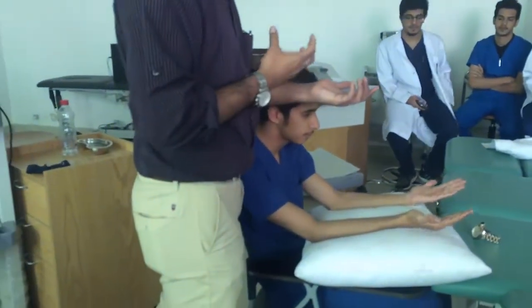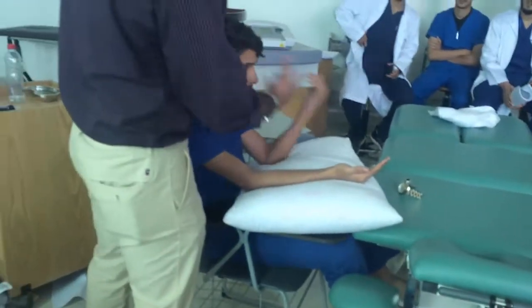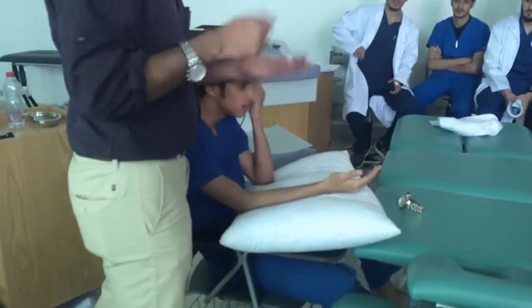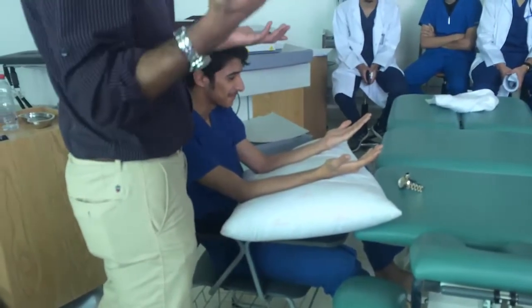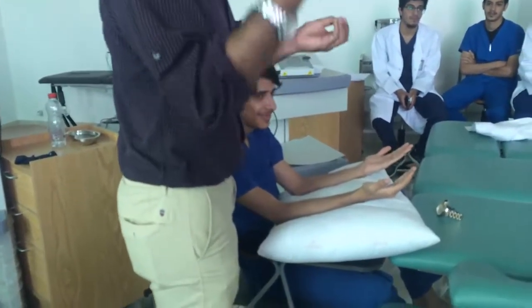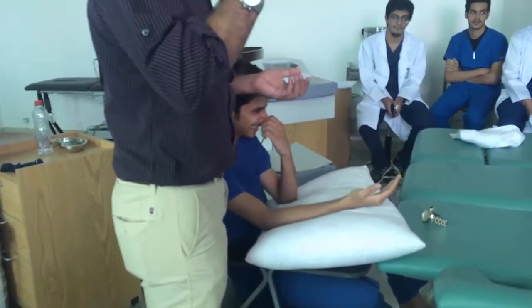the light, it helps in. We're just telling the patient. We should explain to them because they'll think that what we are doing is good. If you just treat like that only, they'll think that it will not have any kind of effect. Psychologically, they'll not feel good. Always we should explain to the patient in a simple way where they can understand. Because psychologically, those things are important.